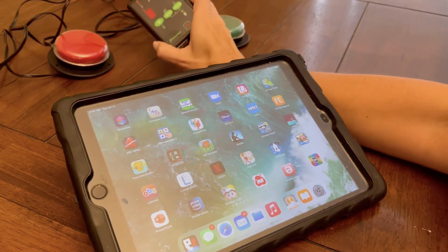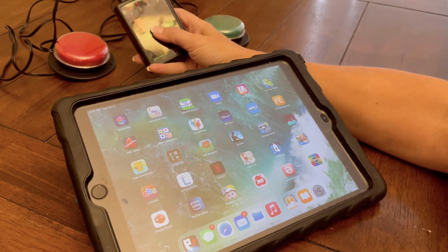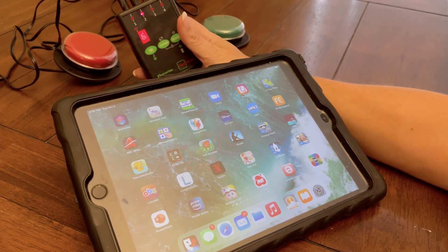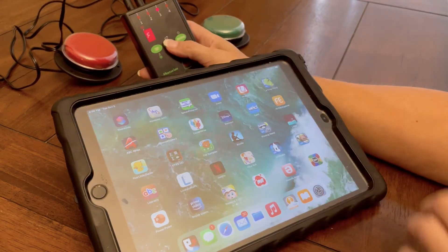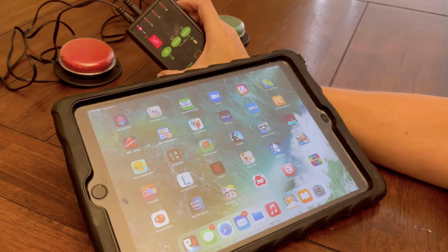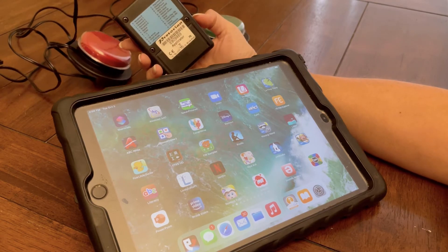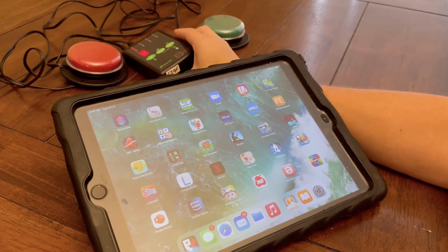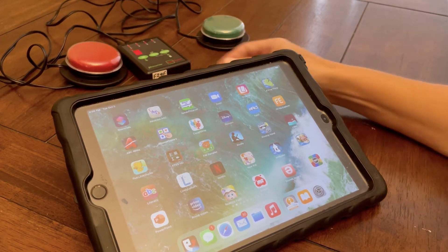This one is set up to use jack 1 and jack 2, which is set up for 5 and 6. But if you're using a different Bluetooth interface, you'll set them up to space and enter. Most are already set up that way.